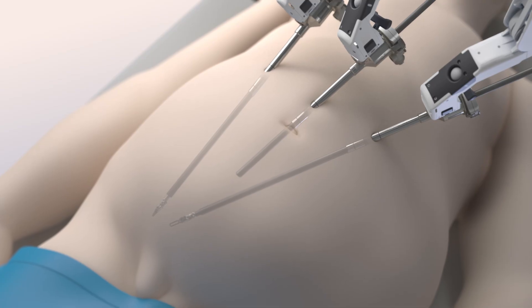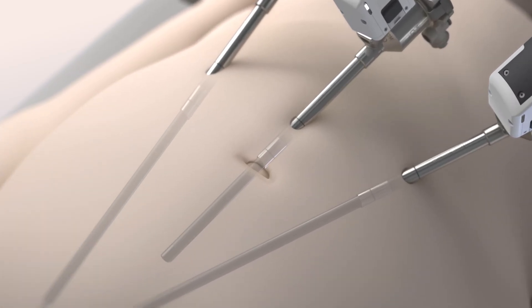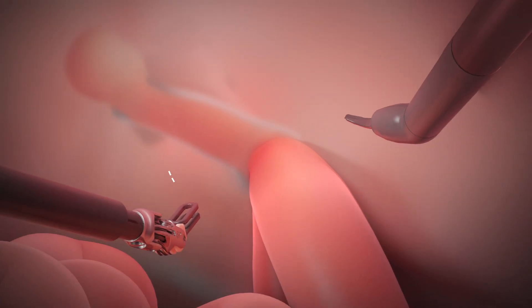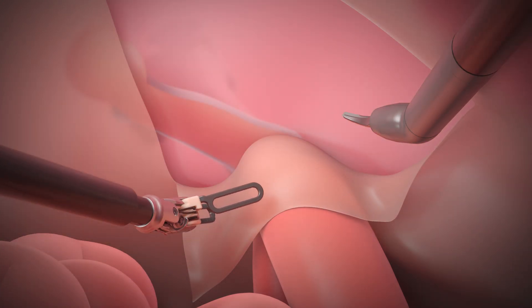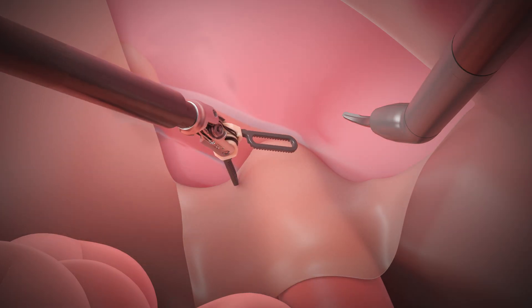The da Vinci system makes it possible to operate through a few small incisions, each about the size of your fingertip. During an inguinal hernia repair, your surgeon opens the tissue flap and carefully removes any tissue caught in the abdominal wall opening.